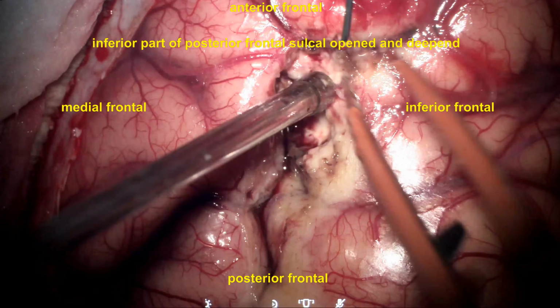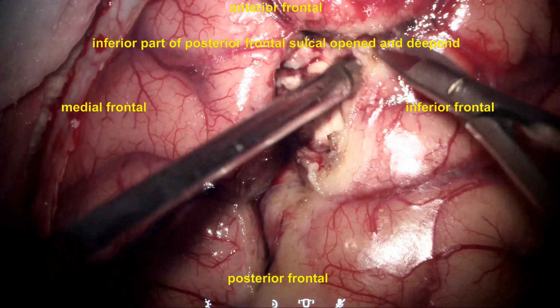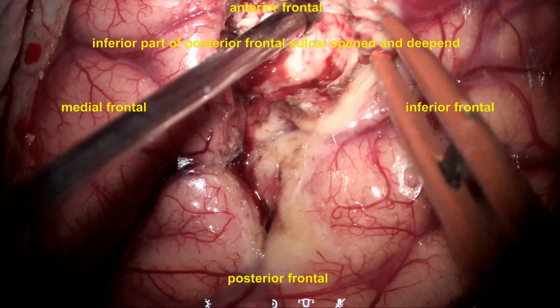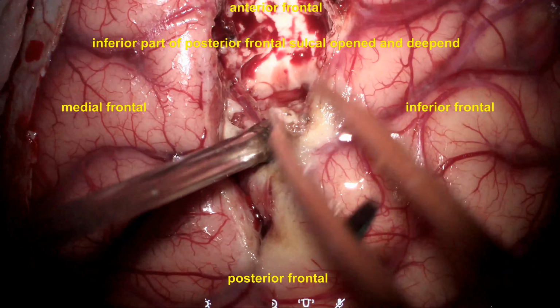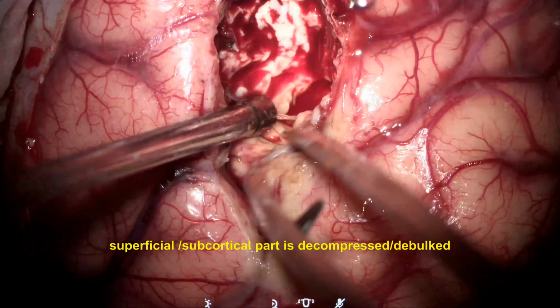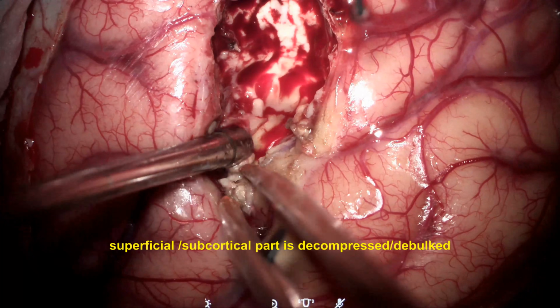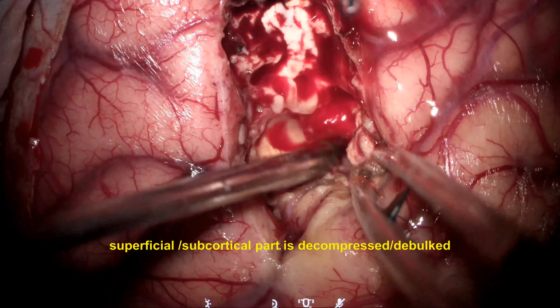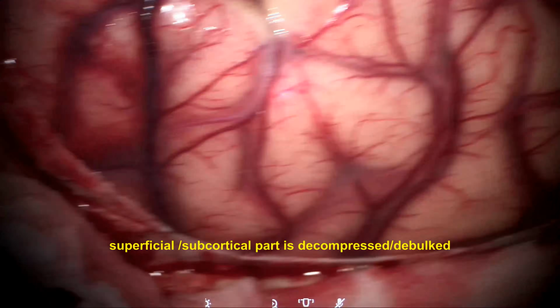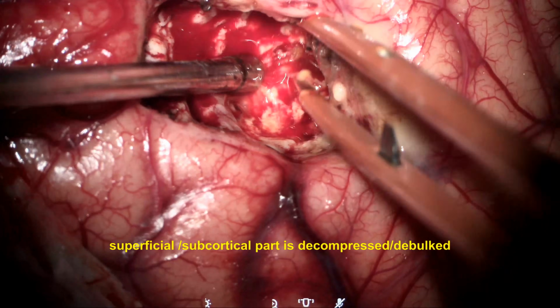Now the sulcus is deepened to a depth of about 1 to 1.5 centimeters. We encounter the tumor, which is necrotic, vascular and ill-defined, creamish yellowish in nature. With high illumination and high magnification, the debulking of the tumor is started. At every stage of debulking and dissection of the tumor, we must achieve hemostasis.